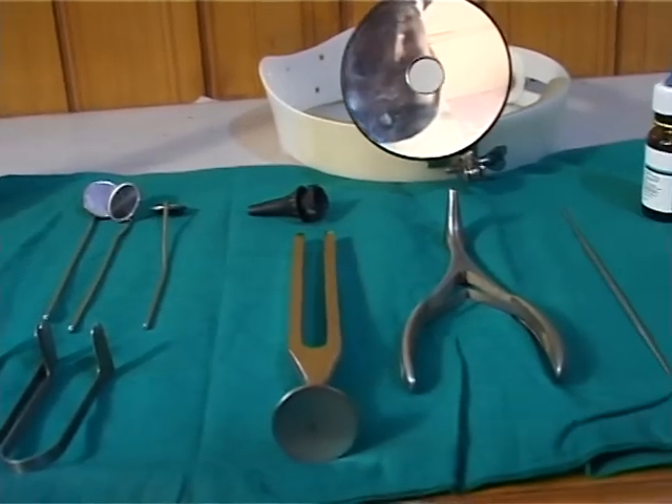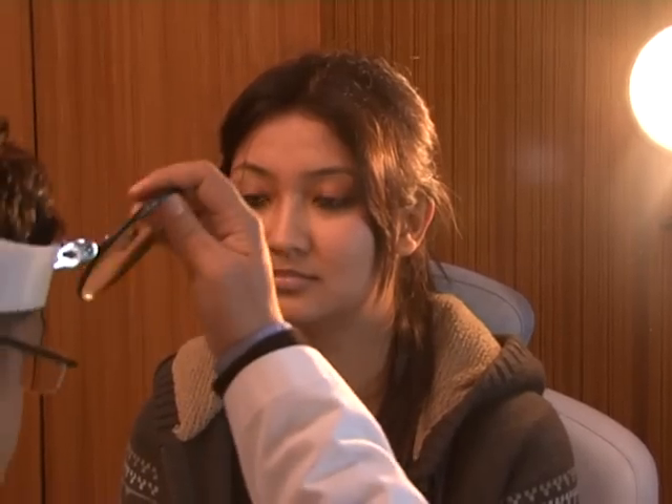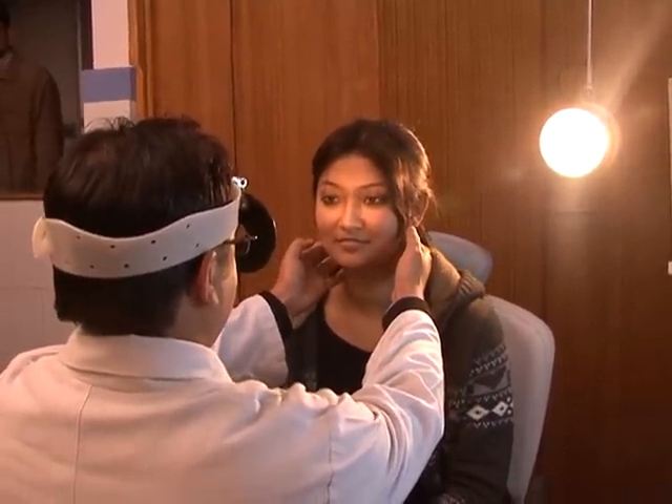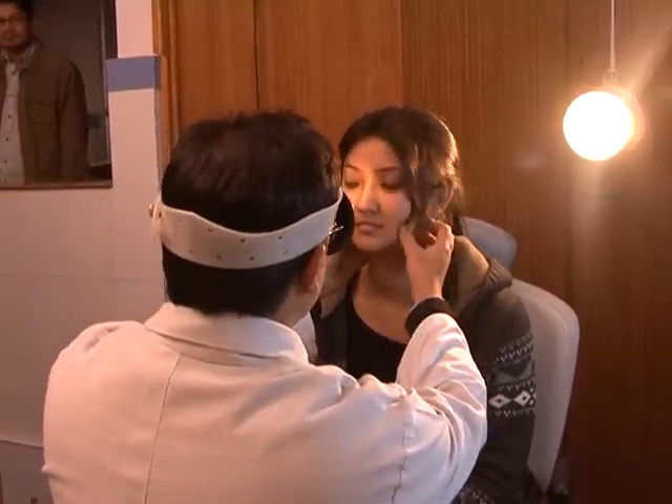The head mirror consists of a concave mirror with a focal length of 7–10 inches. It is fixed on the right eye so that part of the mirror touches the nose, and both eyes should be open while examining the patient.